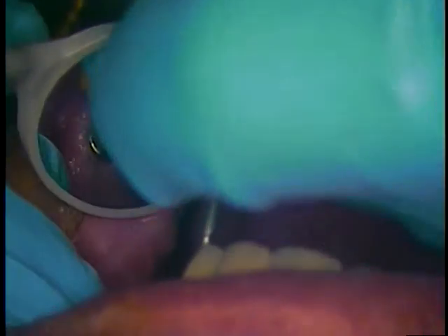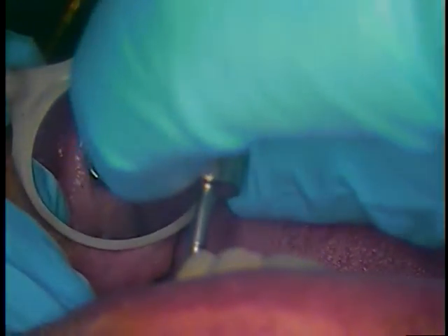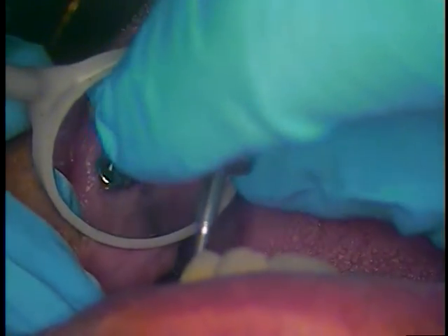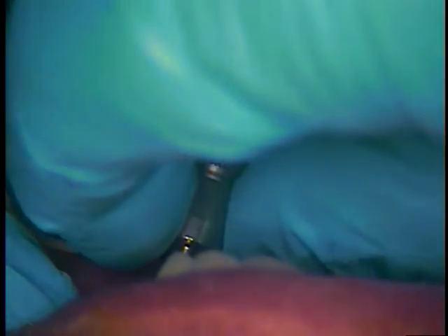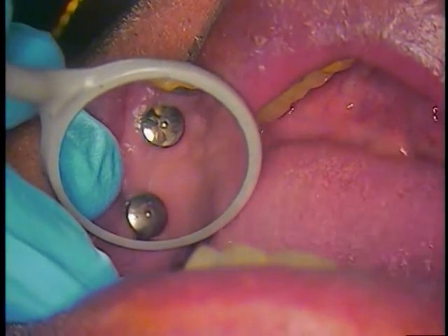Find the screw. Now I'll just start backing these out by hand, then with the driver, and then by hand you can just untwist that.